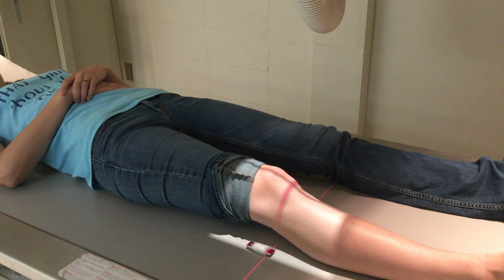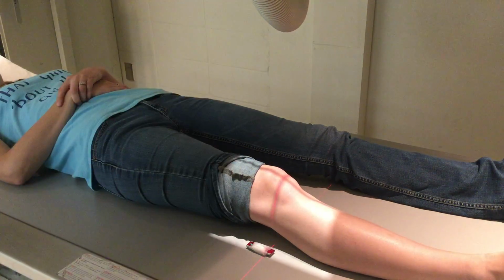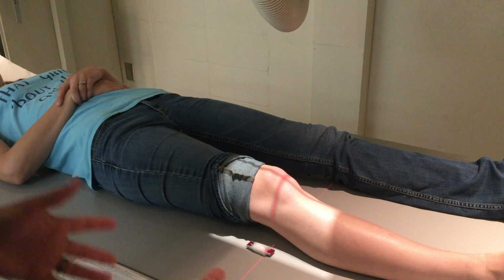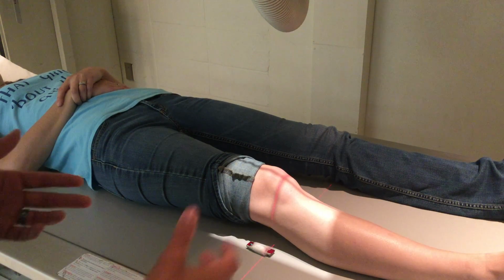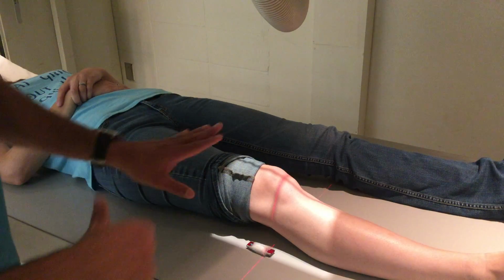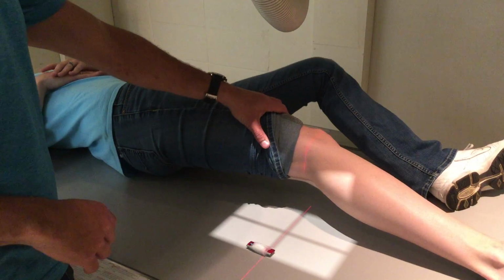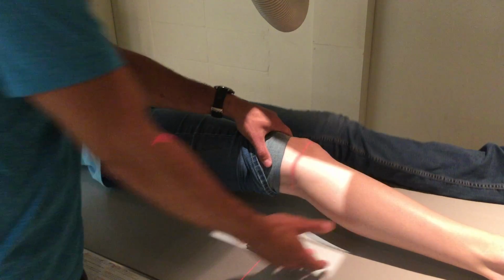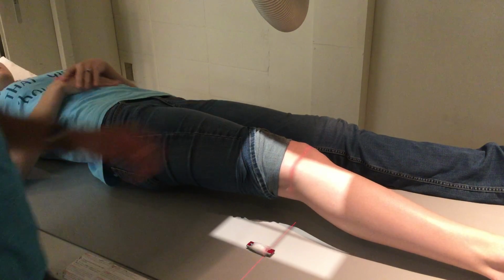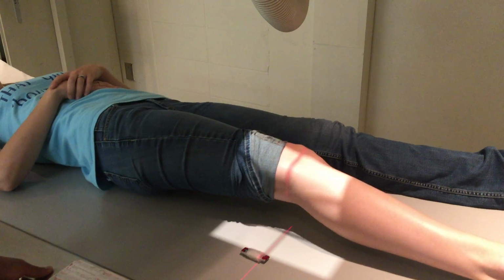All right, so once I do that, I do not have an angle on my oblique. When you take that angle off, recognize you're not going to be lined up with your bucky anymore, so you need to make that adjustment. Just do it as soon as you take the angle off and center back up. Then, okay, what I need you to do is roll your leg in as far as it'll go, right about there. Straighten it the best you can while it's rolled in. Super awkward for this one. Some people are like, I can't. So you can always put a sponge under their butt to help support them.